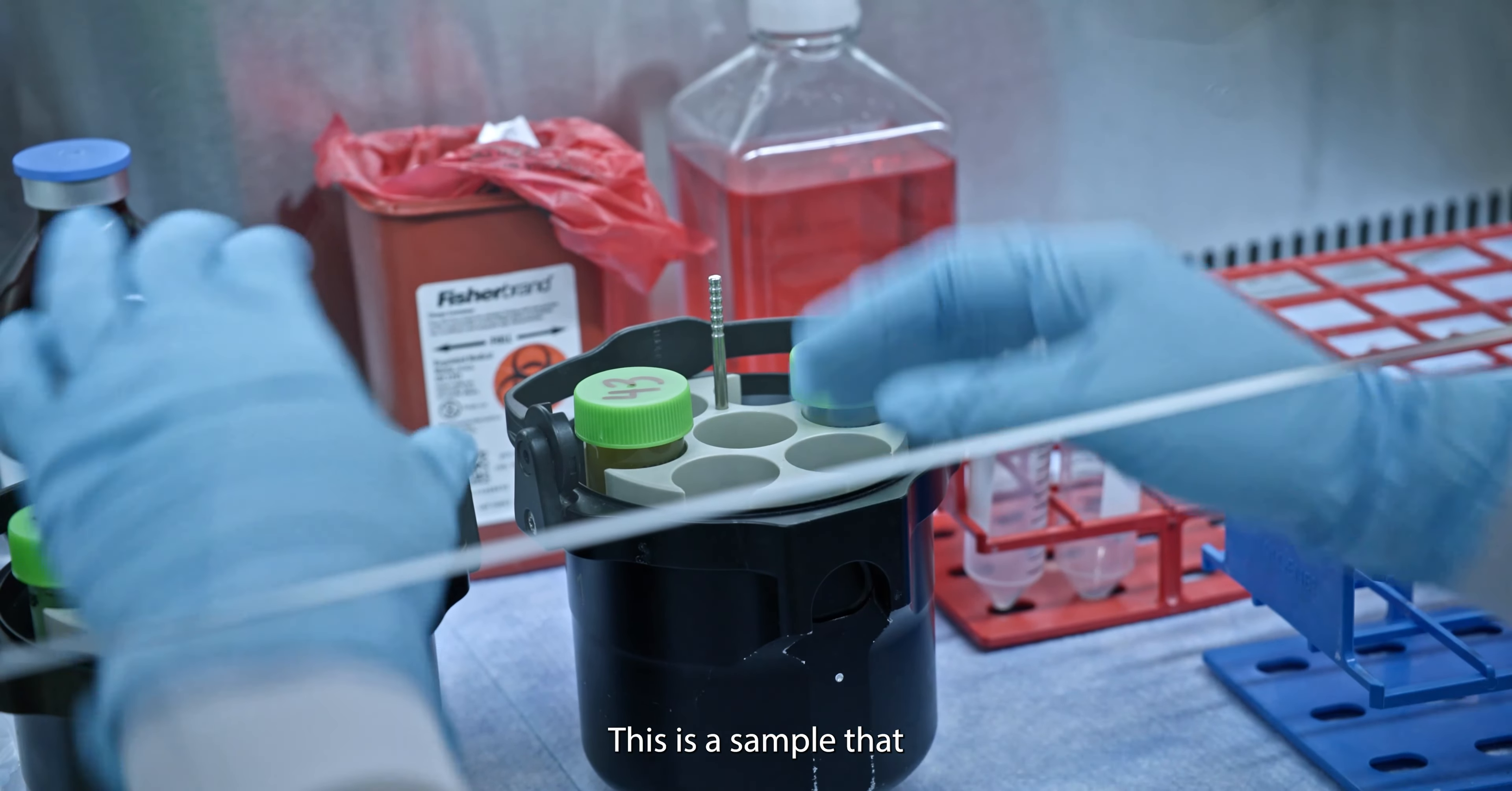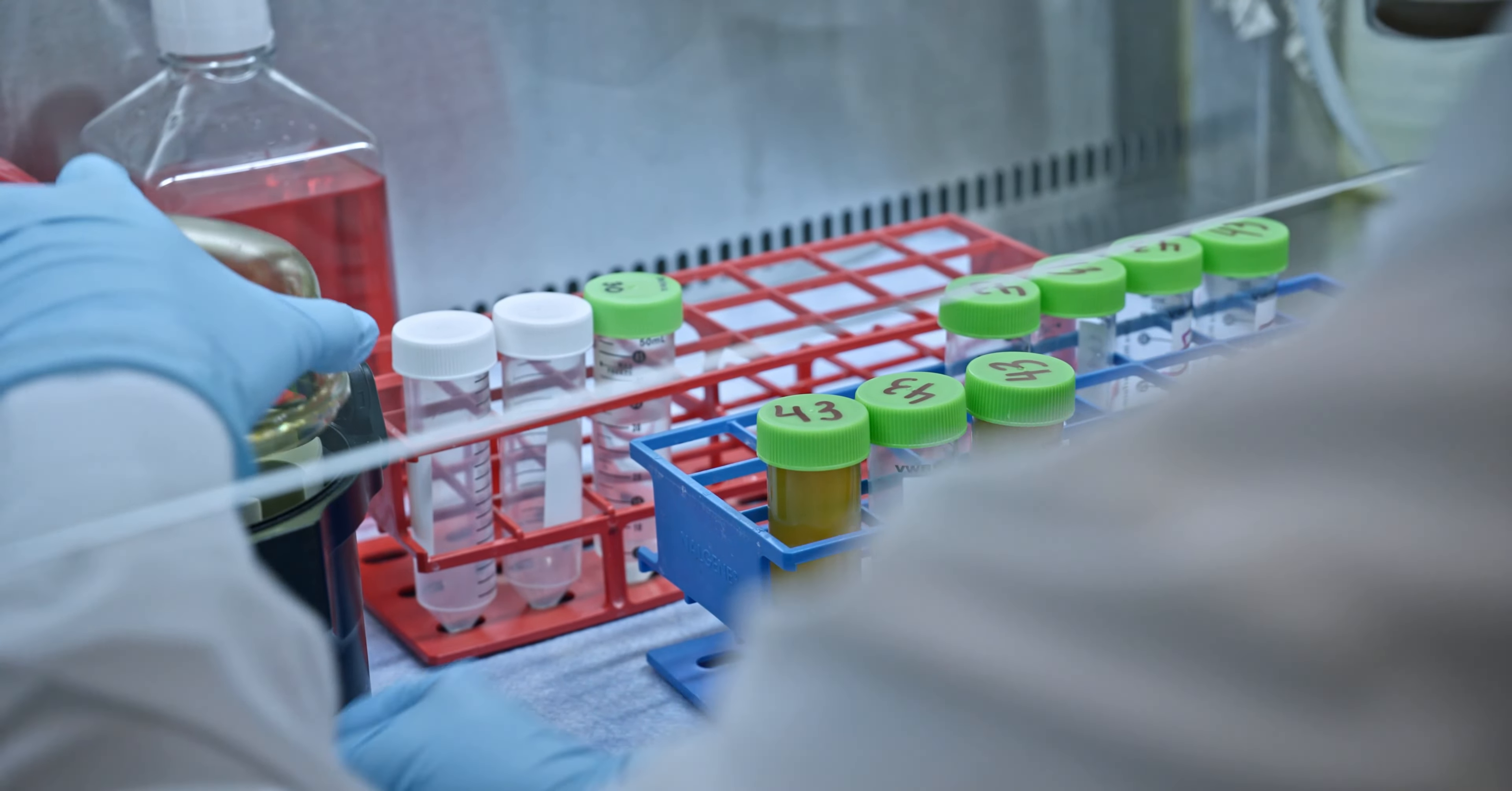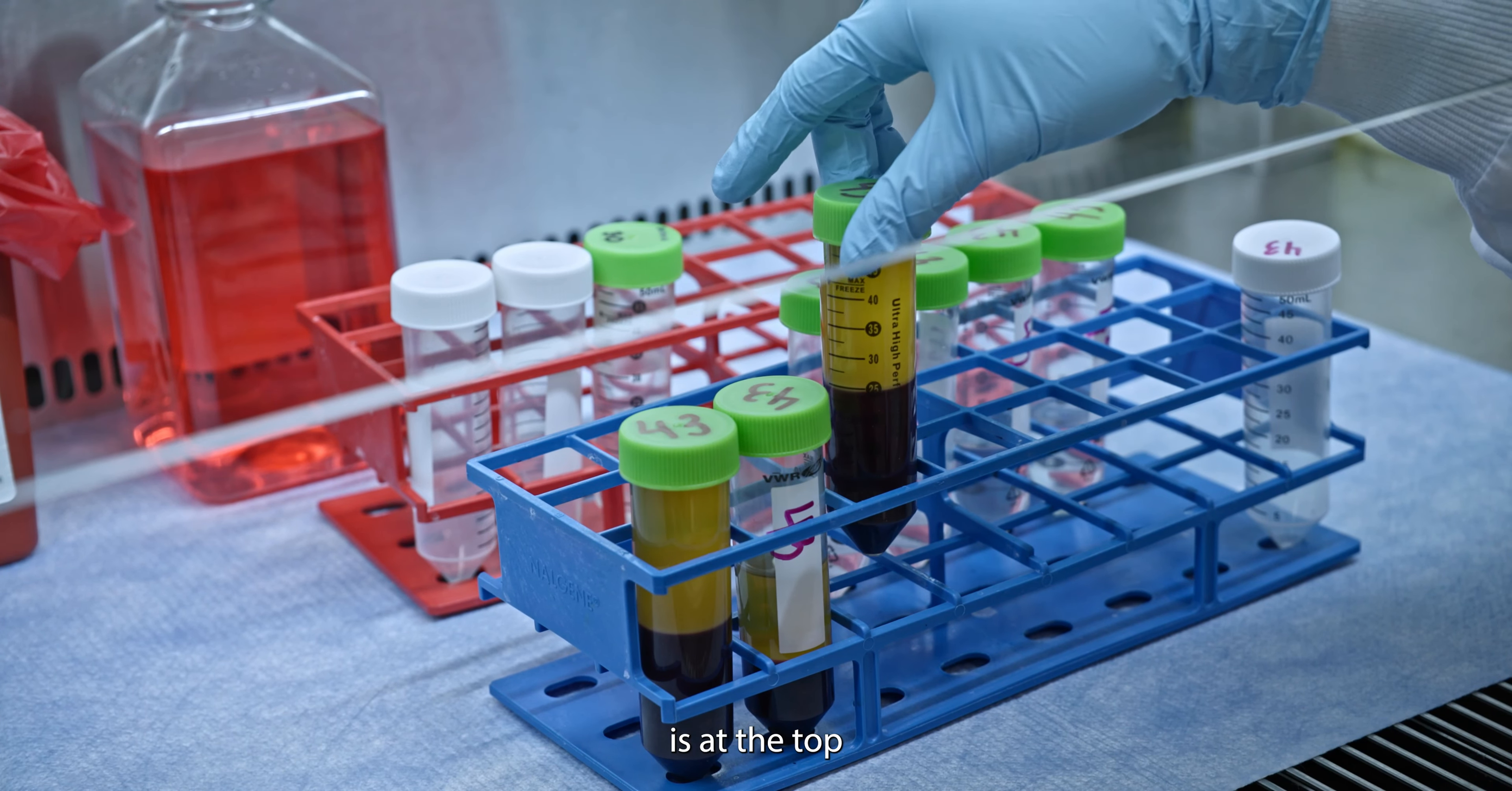This is a sample that just finished its first spin, which is what we put the earlier sample on. And you can see all the cells are on the bottom, while the plasma liquid component blood is at the top.